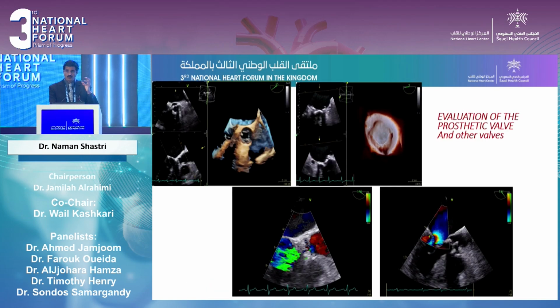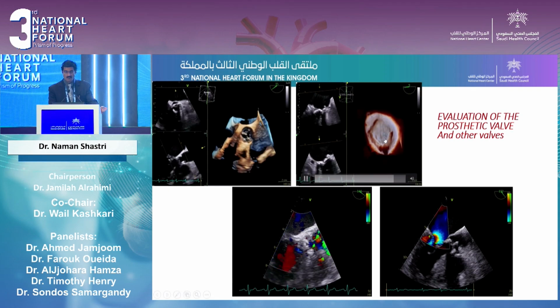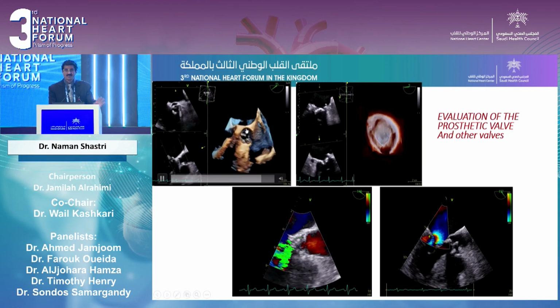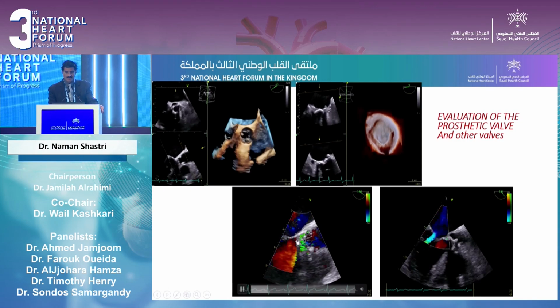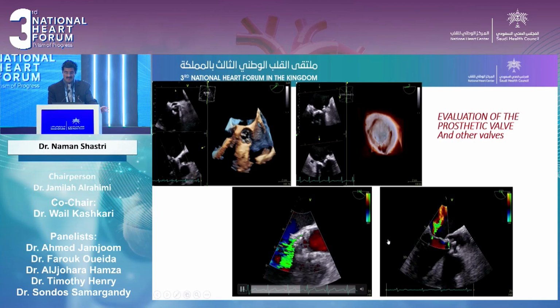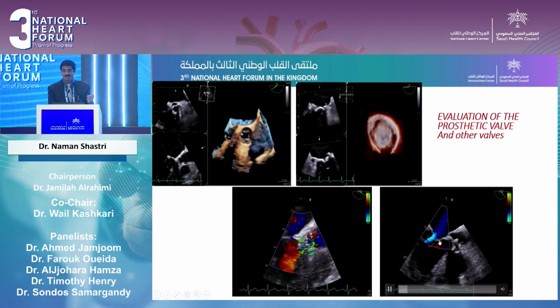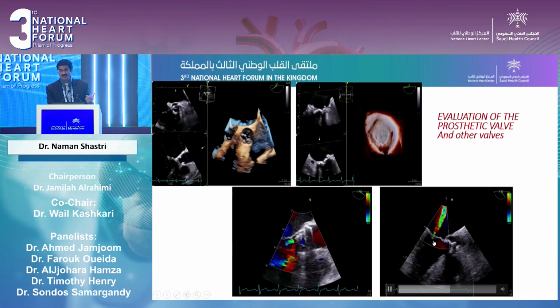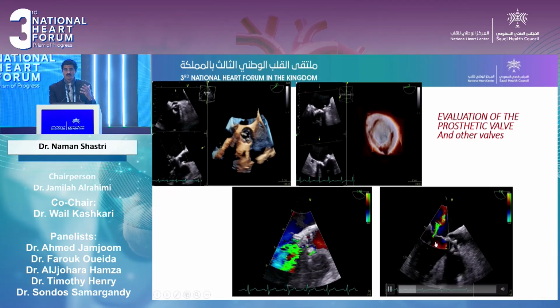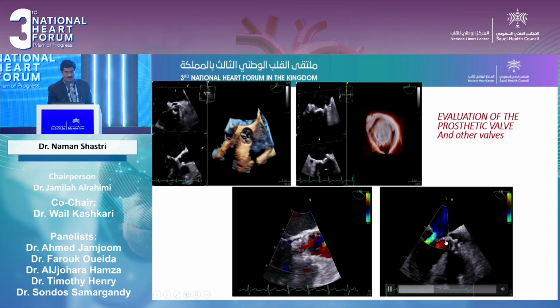So if we want to evaluate the preoperative assessment, the important aspect is to look for the calcification of the valve, degeneration of the valve, and the size of the previous valve. That is very important. Along with that, where the regurgitation is from and what is the condition of the other valves, whether they are degenerative, like MR. If the patient has AVR with MR, AR, MR, TR, severe PH, we should really address all the valves rather than doing only the valve-in-valve procedure.